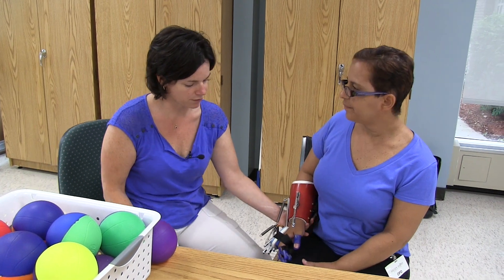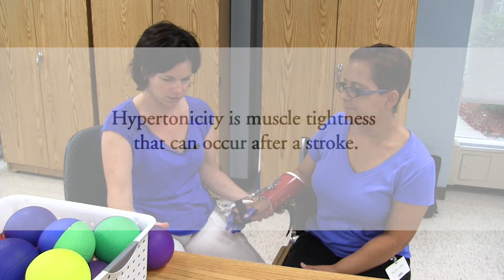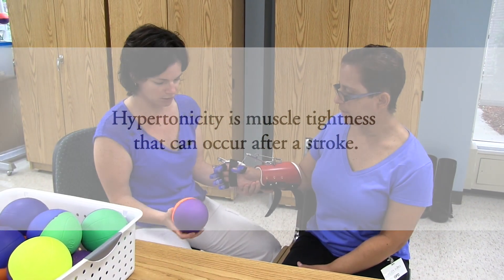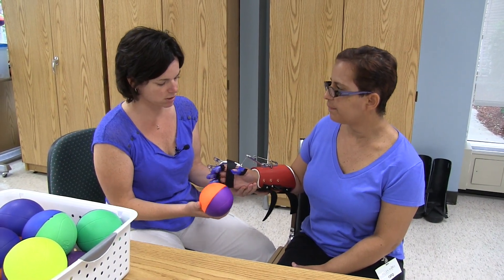She has no use of her hand because of the tone without the Sabo device. She started back to therapy and tried the Sabo, and she's able to have gross grasp and release using the Sabo.